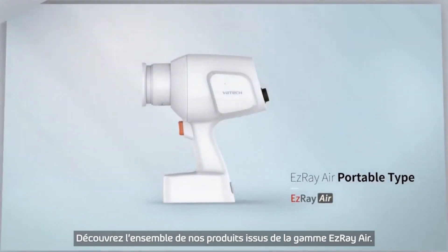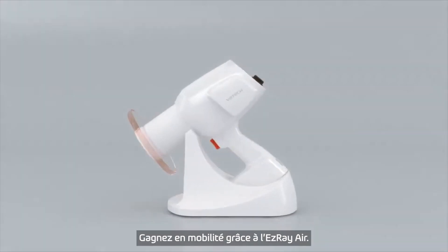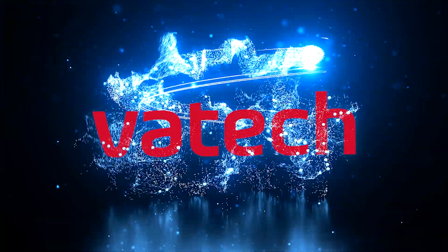Meet our EzRay family with different types of EzRay Air. Upgrade your mobility with the EzRay Air. Vatech.